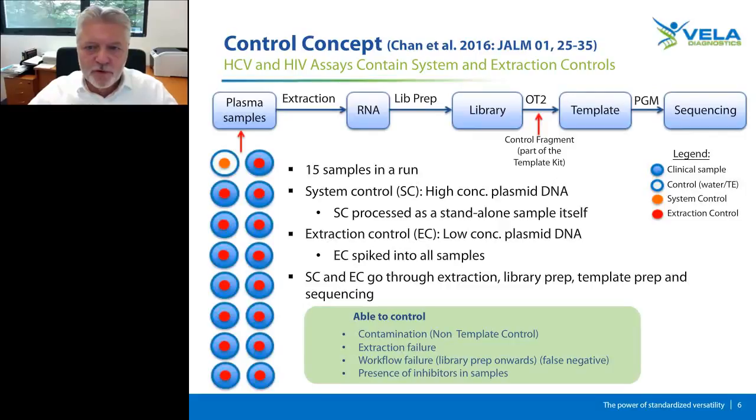One important thing for NGS, in contrast to single gene detection where quality control is well established, is that this is not the same for NGS. So we had to develop our own control concept here. If you want more detailed information, refer to the publication cited in the headline by Chan and co-workers, 2016, in the Journal of Applied Laboratory Medicine, where we published a lot of detail about the control concept.